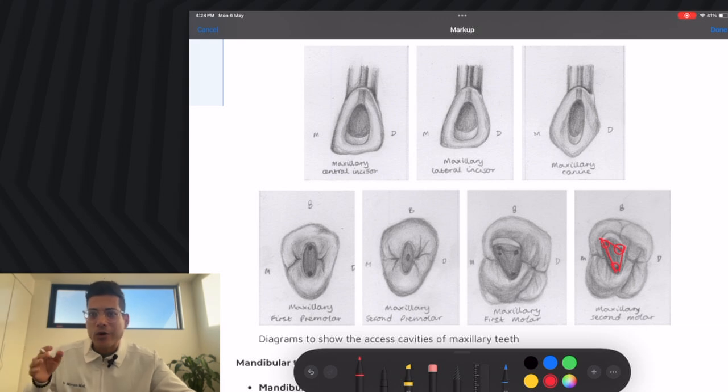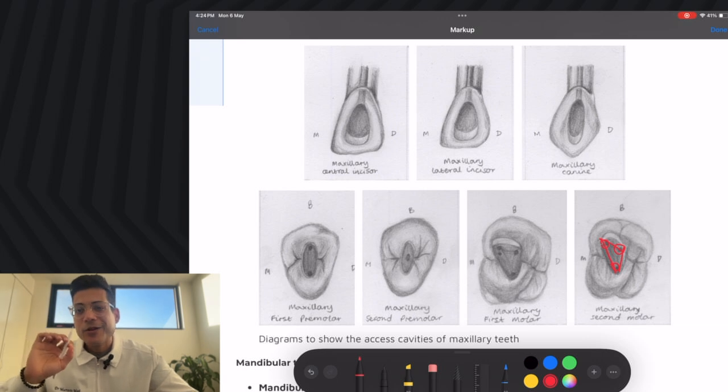Not removing more, not removing less, and still nailing on the head how to pass the exam while not being under. When you look at the upper first molar, premolar, you'll notice it gets trickier when you look at the lower molar and the upper premolar. The concept remains the same.